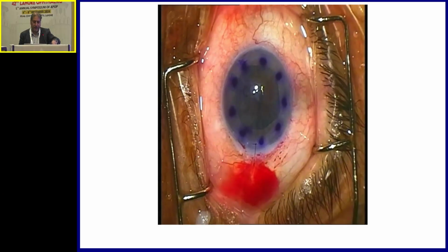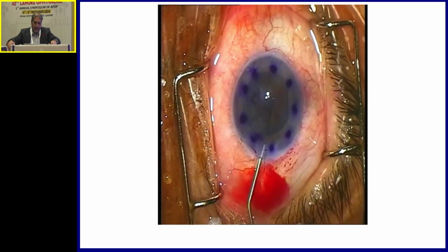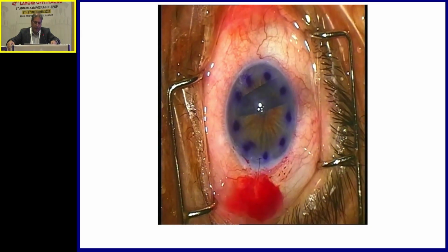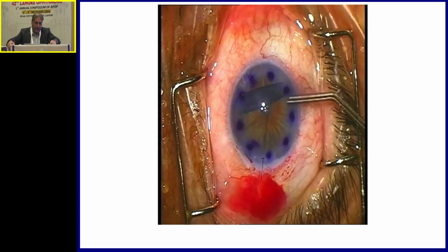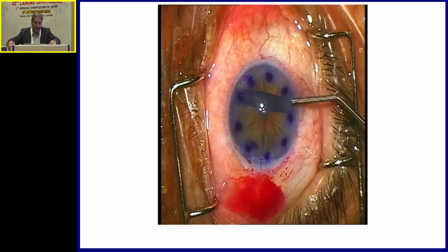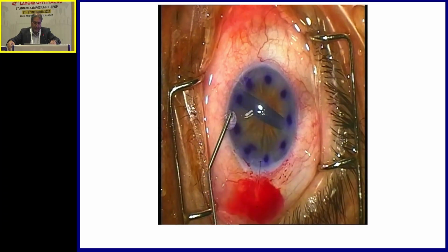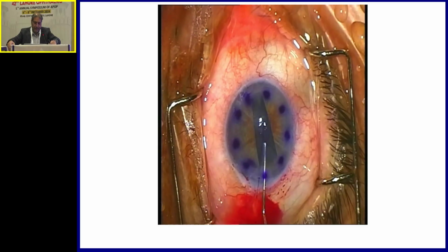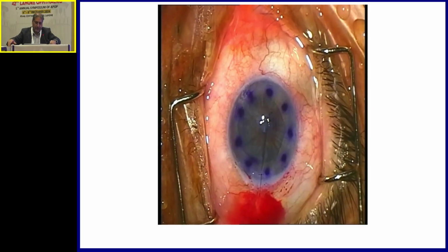Yes, inverted. So we have to actually roll back. You can see here, I'm just, yes, look at this. So now, just a gush of fluid, and now it is in the right position to unfold. Now you can see the right orientation of the S.